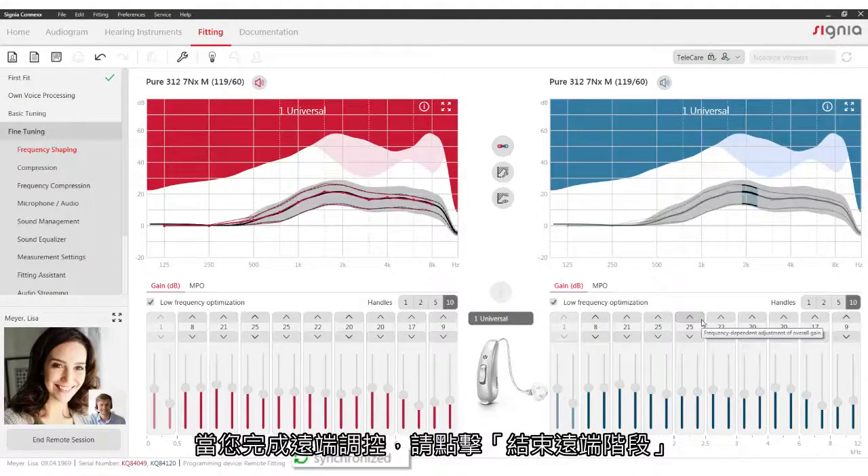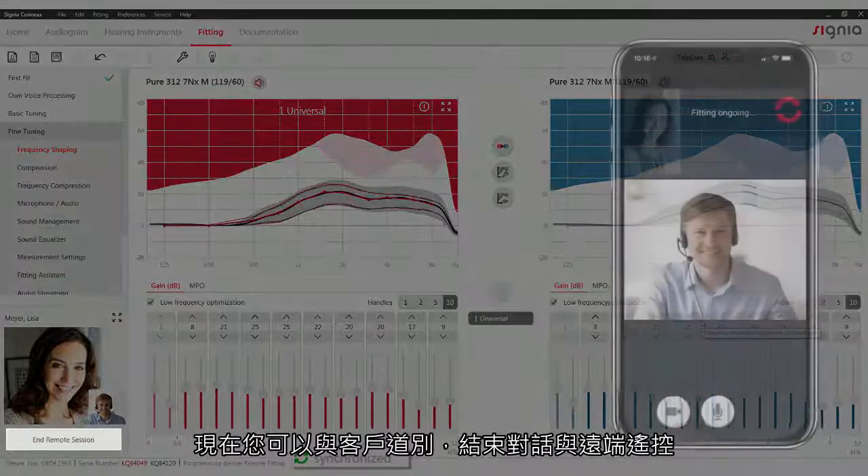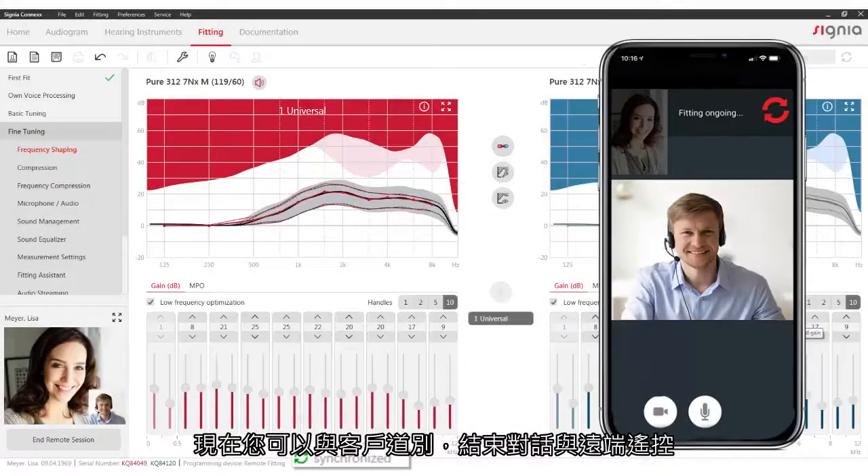When you are finished with the remote adjustments, click on End remote session. Now you can say goodbye to your client and end the call as well as the remote session.